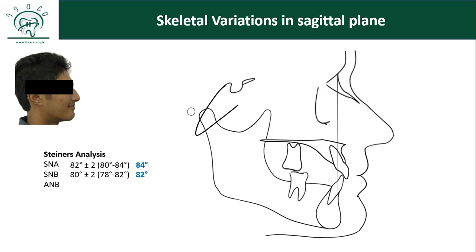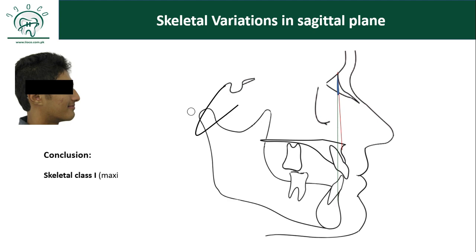One more important measurement is the difference between the NA line and NB line — the ANB angle. You don't actually have to measure this angle directly; if you subtract SNB from SNA you will get the result. In this patient, the difference between SNA and SNB is around 2 degrees (84 minus 82), which is in the normal range. The ANB angle tells you the actual discrepancy between the upper and lower jaw in the sagittal plane. How would you conclude? This patient has a skeletal Class 1 relationship because the maxilla and mandible are in a normal relationship in the sagittal plane — the ANB value is between 0 and 4 degrees.